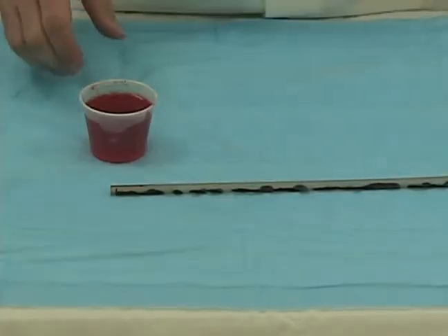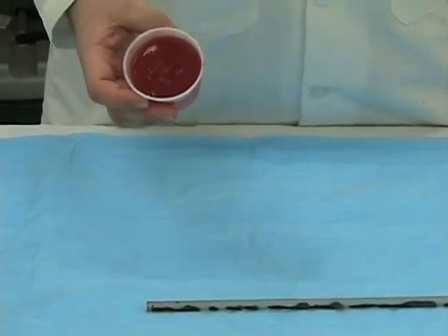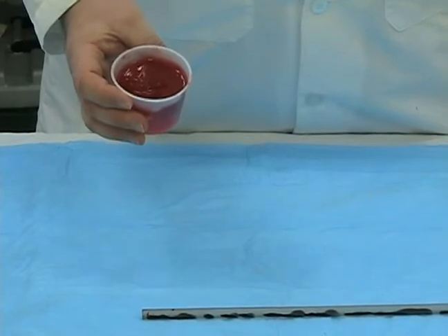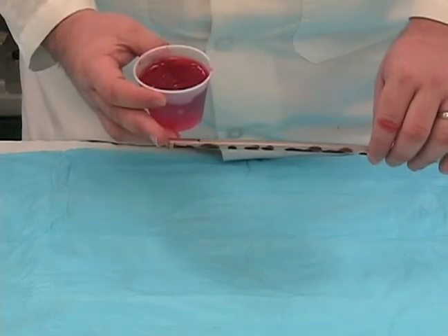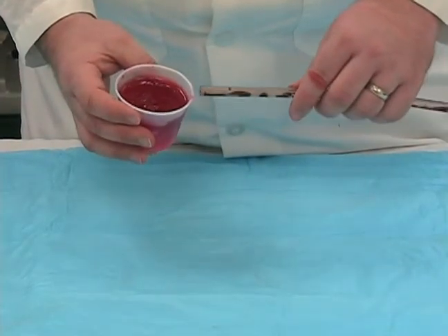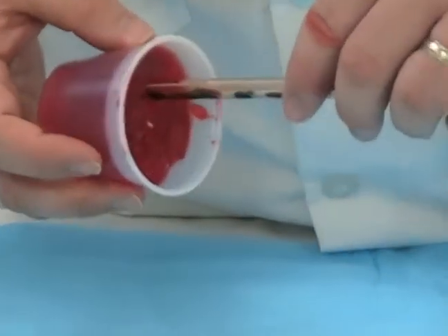manipulated. To simulate our clot, we use red jello that we got from our dietary department. If you wish to make it darker and more realistic looking, add some simulated powdered blood concentrate. Take the chest tube that you've pre-prepared, and we're now going to insert it into the jello. Take care not to insert it too much, because you want the jello clot to be able to be manipulated.